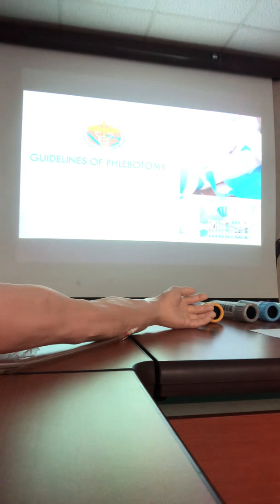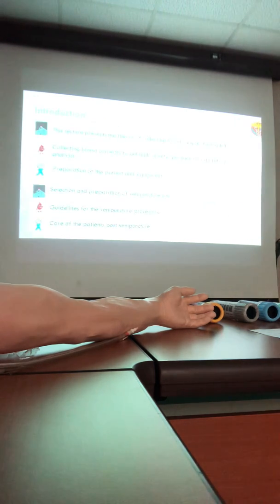So the three different phases are pre-analytical, analytical, and post-analytical. The blood extraction is in which phase? The pre-analytical.